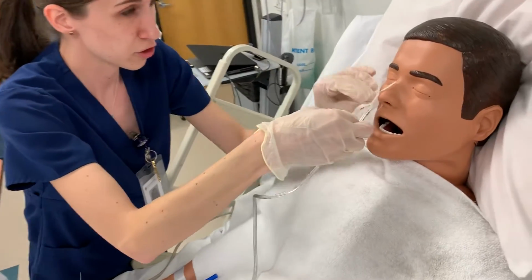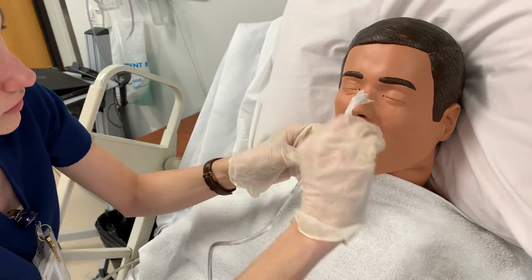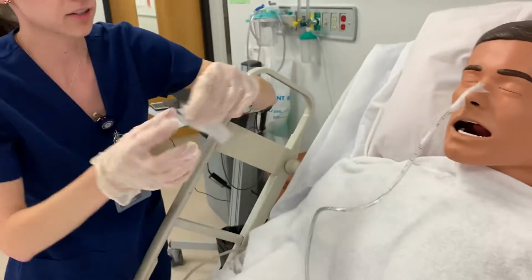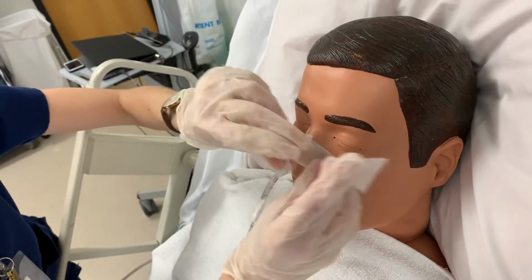And in most institutions you could also have a securing device as well. Sometimes they wrap it a little bit differently depending on where you're at. So again, that is secured. I put my split tape first, and then you put, I feel like this is more than 3 inches, and place that on top to secure that.